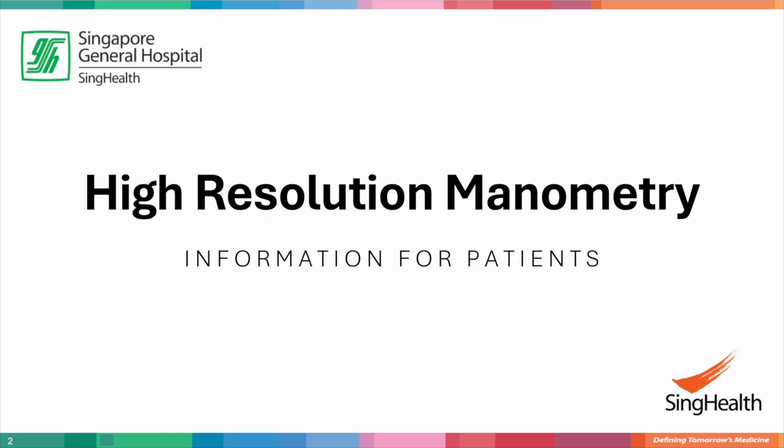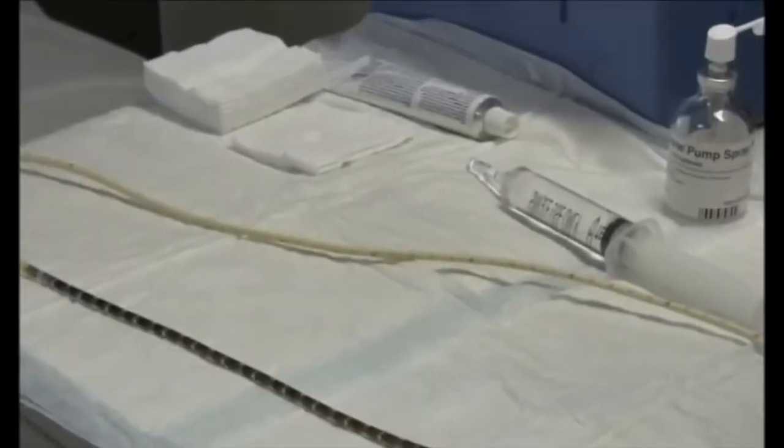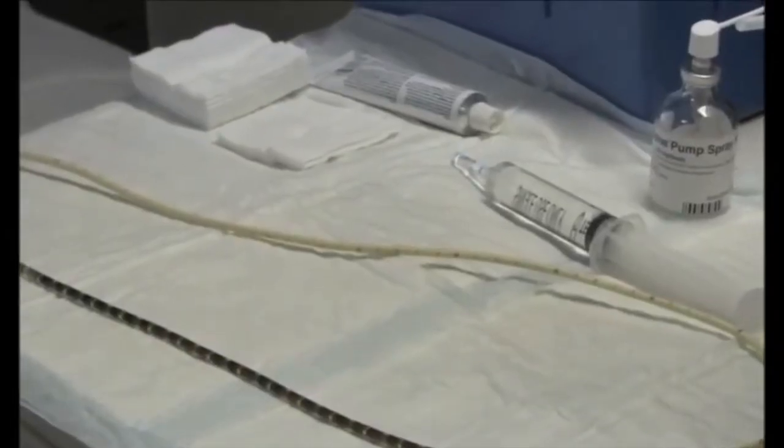This video will demonstrate the procedure for high-resolution esophageal manometry. This is the catheter that will be inserted through your nose.